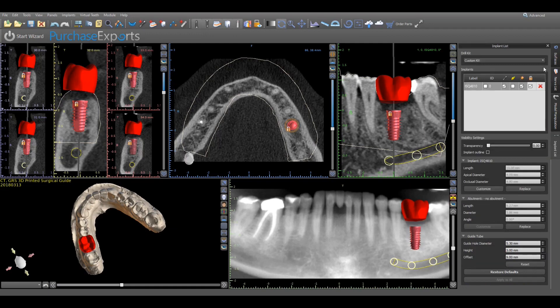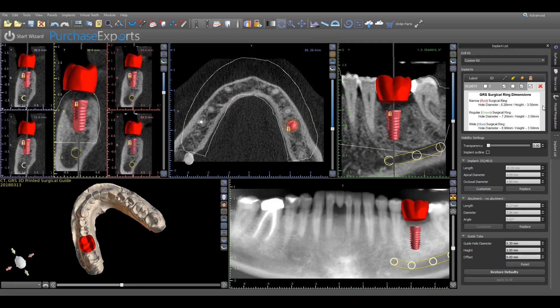Click on the implant list tab on the open panels menu on the right and select custom under the drill kit heading. The guide hole diameter and height dimensions need to be manually entered in the guide tube sub-panel in order to have the correct guide tube dimensions for the GRS surgical rings. Dimensions for all three different size GRS surgical rings have been provided under the implant subheading for this video and are available at grsguidesystem.com. For this video we will be using the dimensions for the regular GRS surgical ring, and both dimensions for the guide hole diameter and height are simply entered in their respective locations under the guide tube subheading.